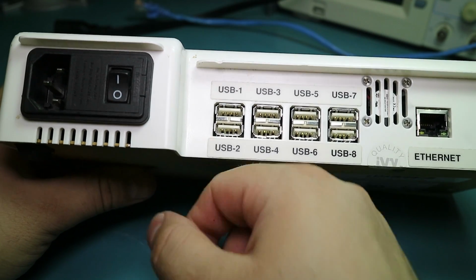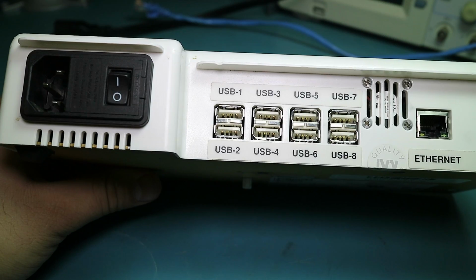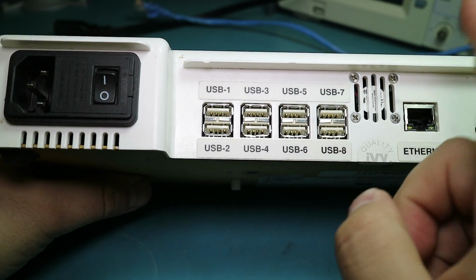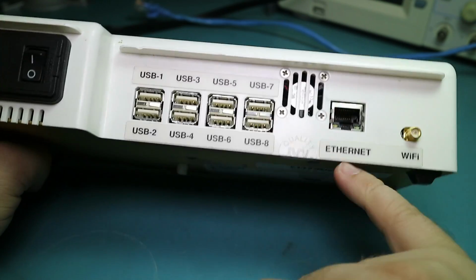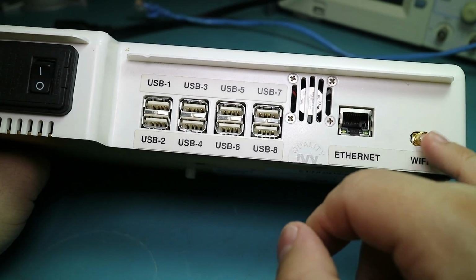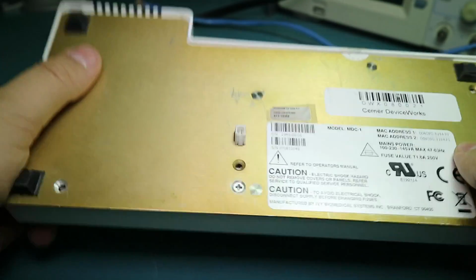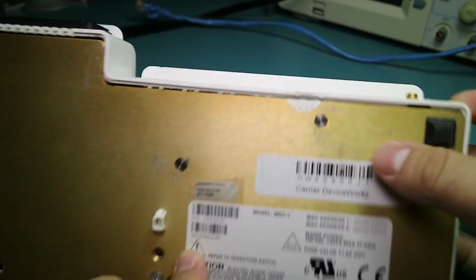So this whole system seems to be geared around a reception area. As you can see, we have 8 USB ports, a small fan that's like 20 millimeter or 25 millimeter, an Ethernet port which is 100 Base-T, and Wi-Fi, which I believe is 802.11b and g. And on the bottom, which I've already unscrewed, there is a small connector.